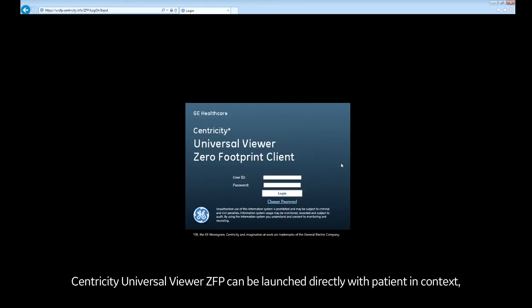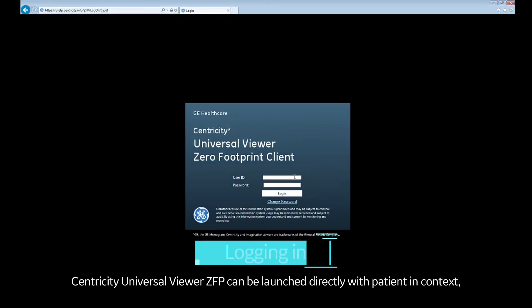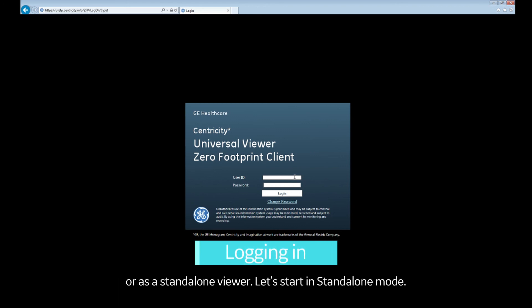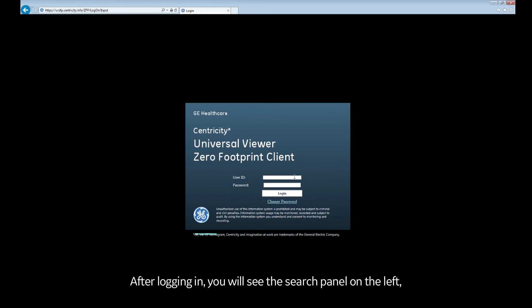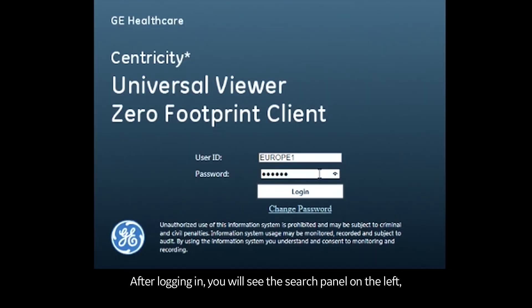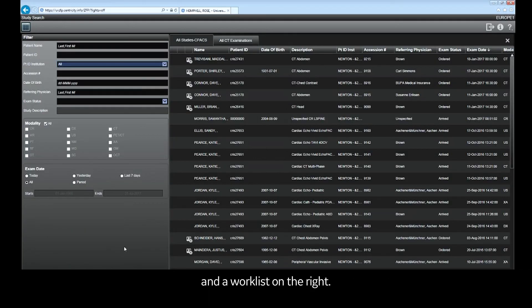Centricity Universal Viewer ZFP can be launched directly with a patient in context or as a standalone viewer. Let's start with standalone mode. After logging in, you will see the search panel on the left and a work list on the right.